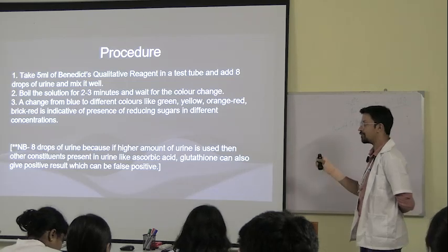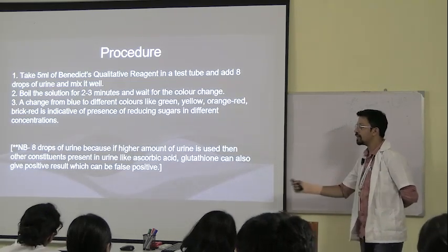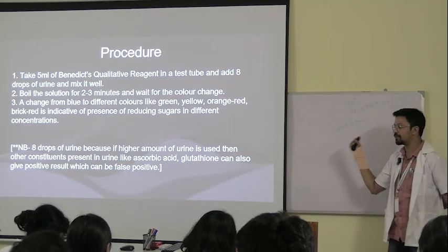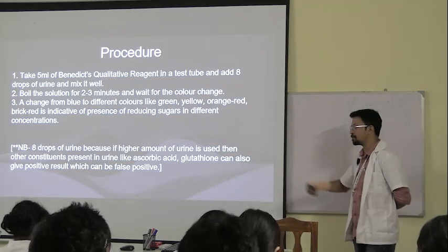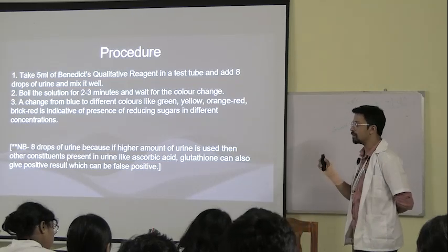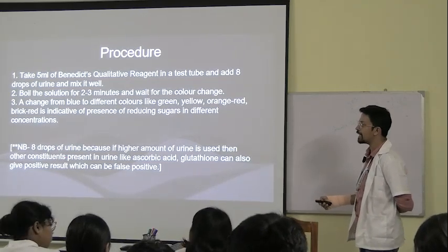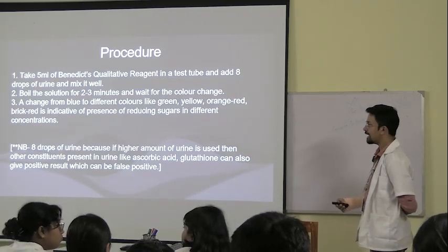And you will come to the inference that the patient is having glycosuria, it could be diabetes mellitus, it can be renal glycosuria as well, whatever the multiple options of the diseases where the sugar is present. But the patient is completely normal. Only because of these byproducts the test is coming positive. That is why we don't add more than 8 drops. We always add 8 drops.